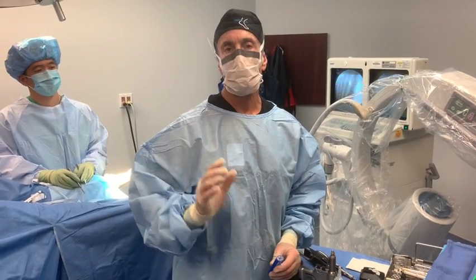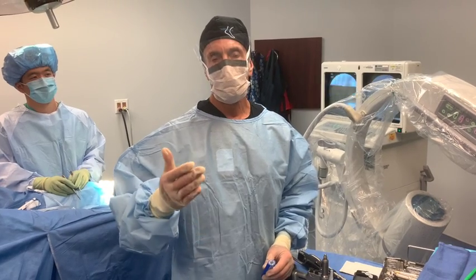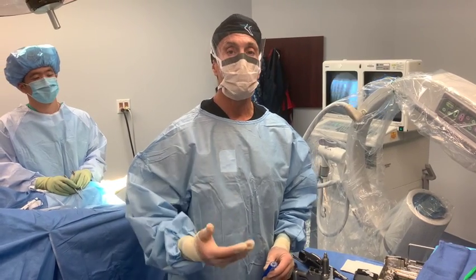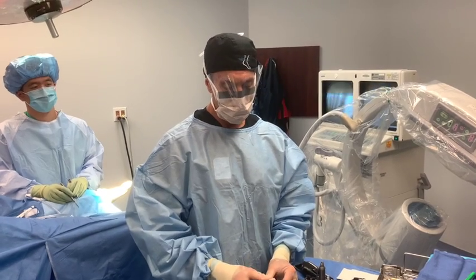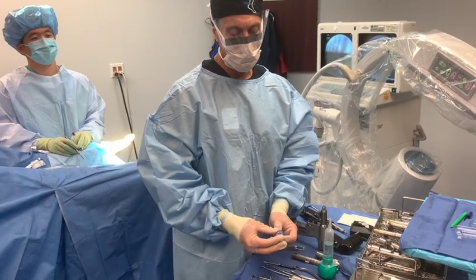Hi, it's Dr. Moore, and today we're going to do a simple hammer toe procedure. Most of my patients do not want a metal pin or metal fixation, and we're going to use the Fusion 1.5 absorbable pin.